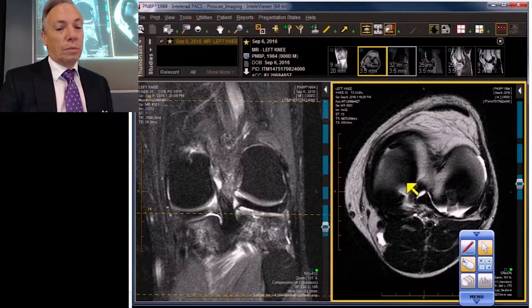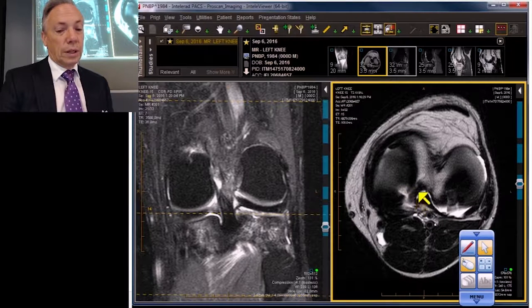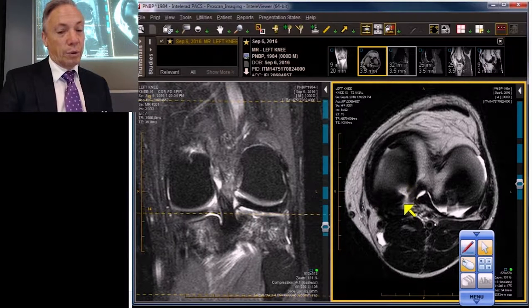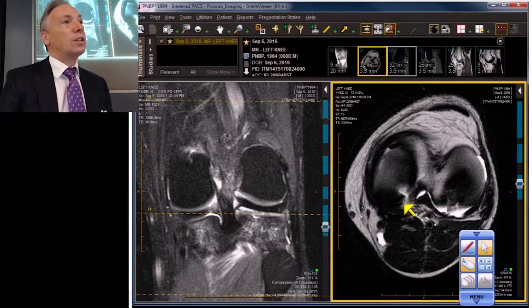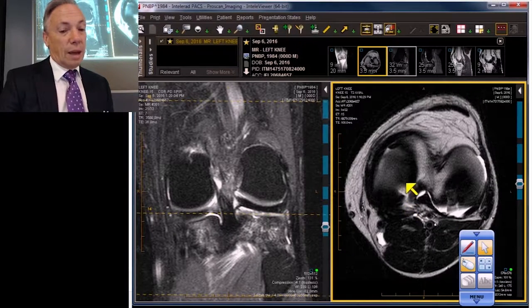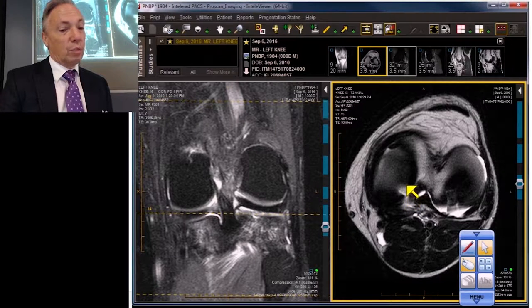And then when you go over to the medial meniscus side, to the root — the area of the root attachment, right here — it is interrupted vertically from anterior to posterior by this high signal area, which represents a radial injury, and a fairly large radial injury at that. You can get a depth of that radial injury; you can get a width, which is a little more narrow here but widens as it goes in.